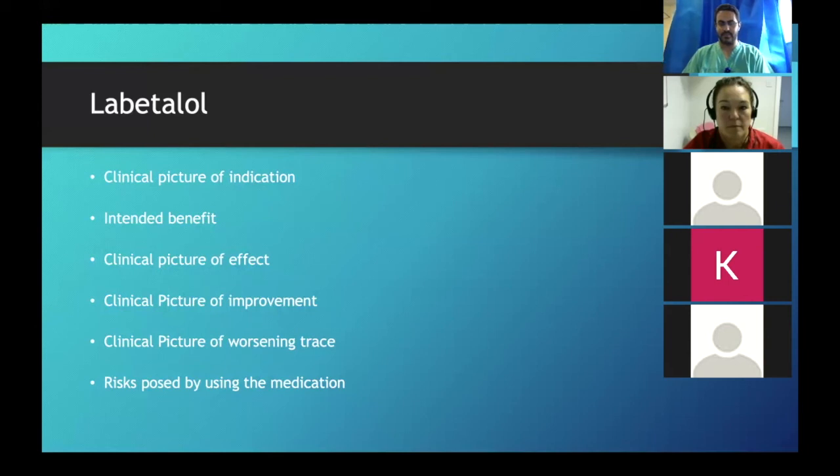Well, I always used to tell everybody it reduced it, but now I don't know why. Well, what is variability? So it will reduce it. That is correct. Why would it reduce it? Oh yeah, because of the sympathetic. Yes, because of the sympathetic. Variability is the interaction between sympathetic and parasympathetic. If you've taken away the sympathetic, your variability will be reduced. So yes. Okay.